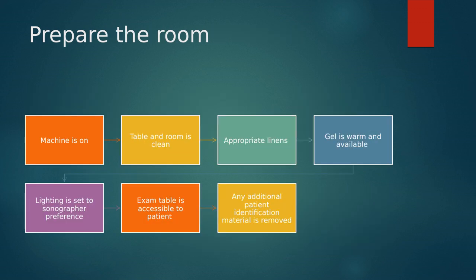So how do we prepare our room? You want to make sure that before you even get your patient in there, the machine is turned on. There is nothing more awkward than pulling your patient into a room and having to wait for that machine to turn on, because now you're making small talk. Maybe your patient's really nervous. Maybe you have a busy schedule that day, and it's all kind of time wasted. So make sure the first thing that you do when you get in is turn the machine on. As we know, it takes a little bit of time for them to boot up, so you want to make sure that your patient is not sitting there waiting for that machine to turn on.